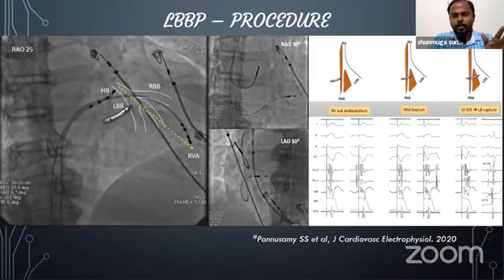See, we are not screwed here. We have just exposed the lead on the right side of the interventricular septum, 1.5 centimeter below the distal His signal, otherwise known as the basal septum. And you have just exposed the lead, then do pacing. Since the anode is still within the sheath, you have to work in a unipolar mode of pacing.